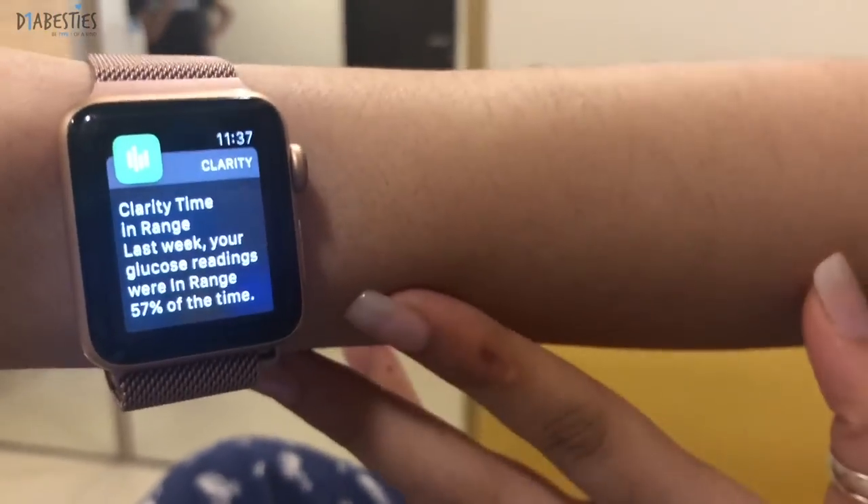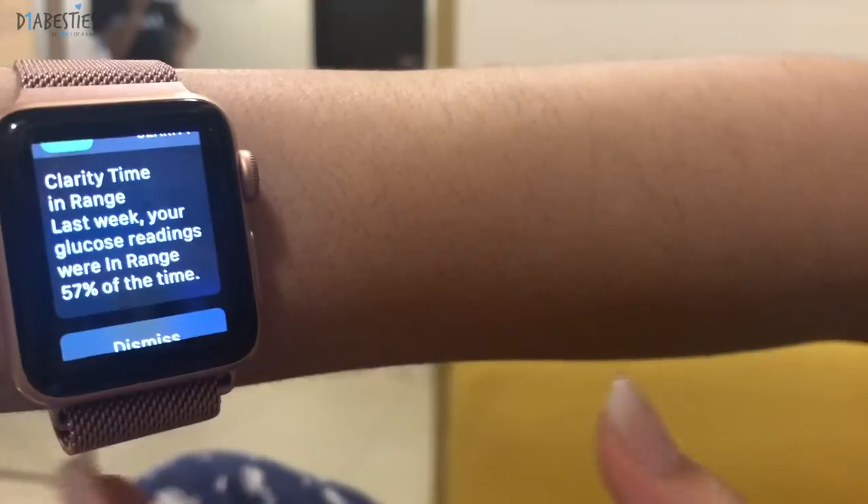I've just got a notification from Clarity, which is so cool. It says: 'Time in range — last week your glucose readings were in range 57% of the time.' This is just brilliant because in a snapshot it showed me my weekly reading. It's been about seven days since I'm using the Dexcom, and now I'm pretty sure when I go onto my phone and check out Clarity I can send my entire weekly report to my doctor. That's a plus 25 billion right now for me!